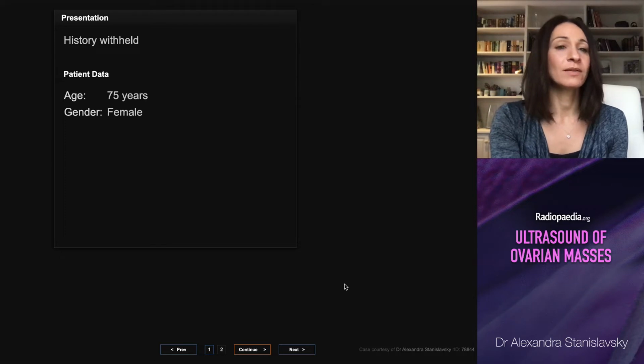Next patient, history withheld. There's something here I'm not telling you. 75-year-old.